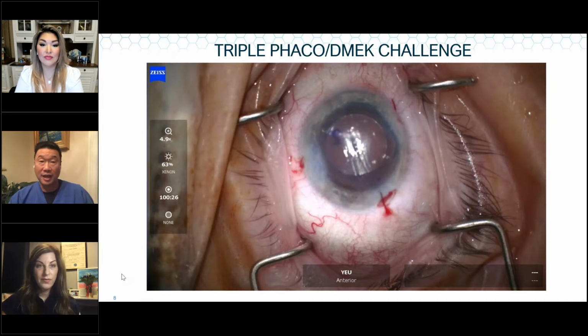Typically, we want to do these cataracts a little sooner. So my DMEK triples tend to be maybe 1 to 2 plus. Sometimes I have a dense lens combined with a Fuchs, then I'm doing a combined case where I'll make the Rexis larger, but I like to make it around 4 to 5 millimeter range if I can. And I usually go with Miochol first, but if that doesn't work, then I'll ask for some Miostat as well. And sometimes that combination will help bring that pupil down.